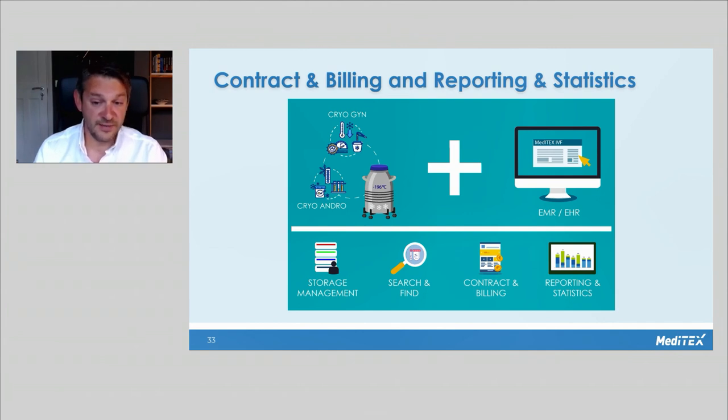The use of cryopreservation management systems built into the EMR can solve both of these issues for the clinic and team. Some systems can generate annual storage bills automatically based on the contract, the expiry dates of consent, the price charged by the clinic, etc.